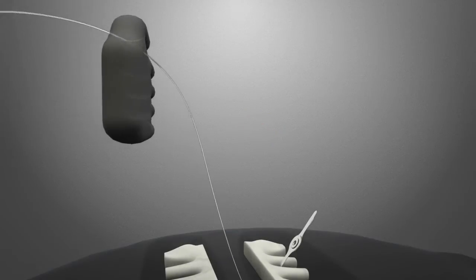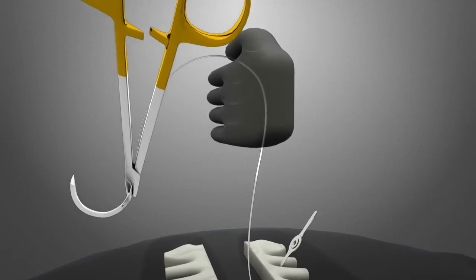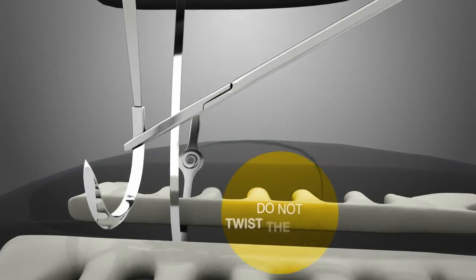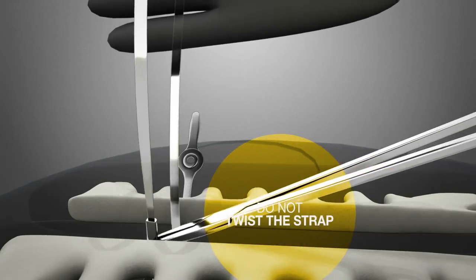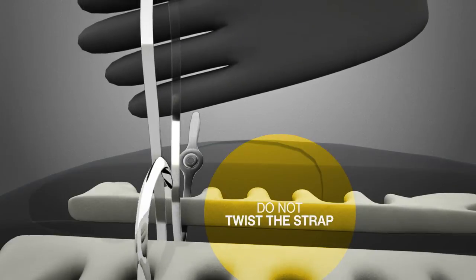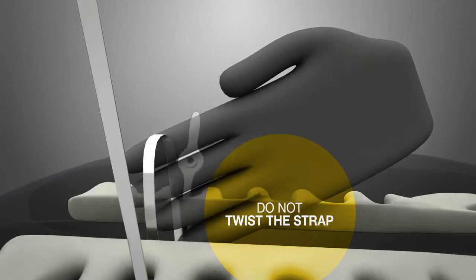The strap is then supported in its arc and the needle is prepared to pass through the near sternal half. It is important to support the strap which lies between the sternal halves so it does not twist as the strap is pulled through the near side.